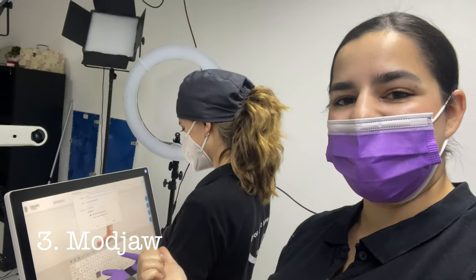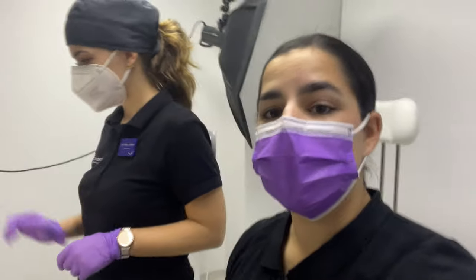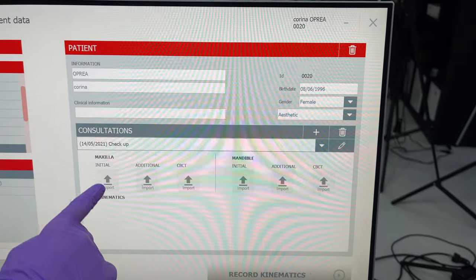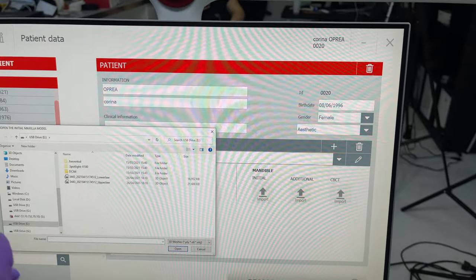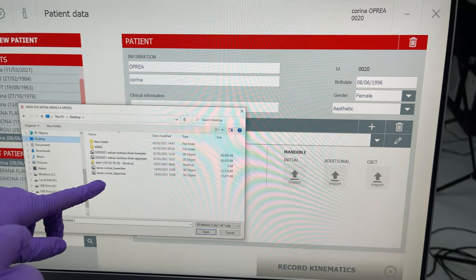The last step is to make the Modjaw, which we're going to learn more about from Dr. Flavia, who will tell us a little bit about it. Okay, so now we're going to export the models from the Cerec and import them into the Modjaw. We're going to create Corina's file in here. So we created her file, and now this is a very important step. We import the files, so we have the upper jaw.